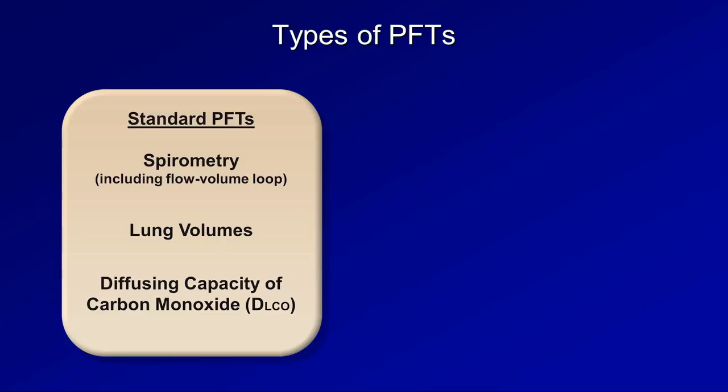Typically, when a physician, nurse, or respiratory therapist mentions the term PFTs, this set of three tests is usually what he or she is referring to. In the absolutely most general sense, spirometry is responsible for diagnosing obstructive lung disease, lung volumes are responsible for diagnosing restrictive lung disease, and the DLCO, in conjunction with other tests, is responsible for suggesting the possibility of pulmonary vascular disease.